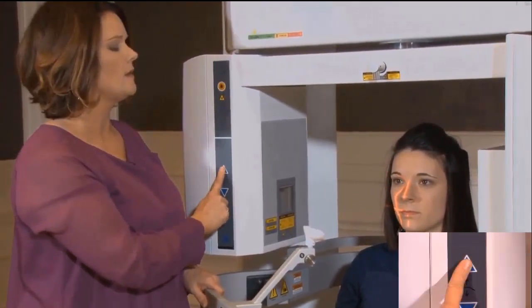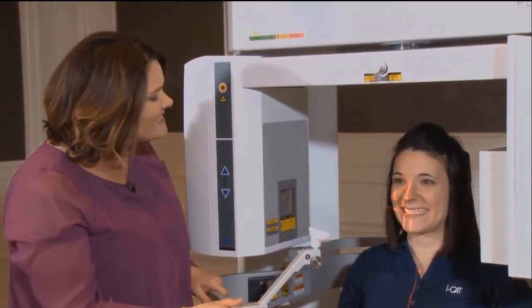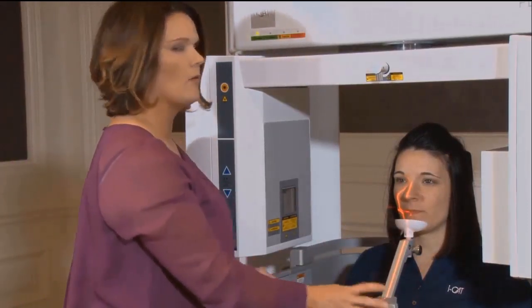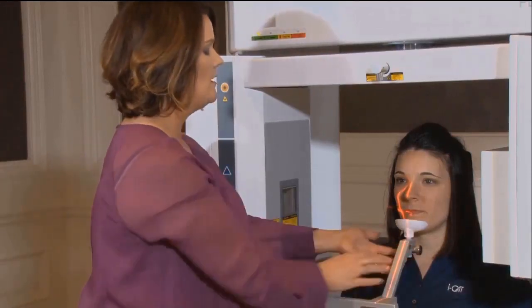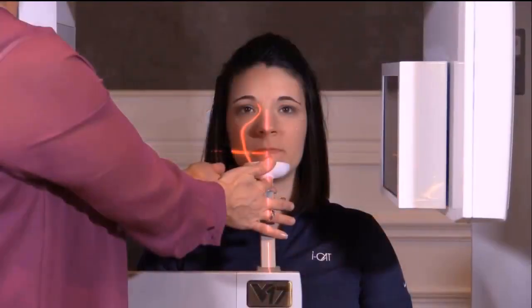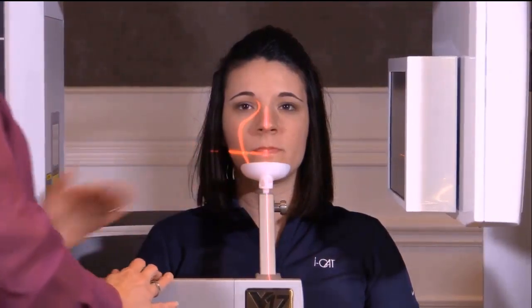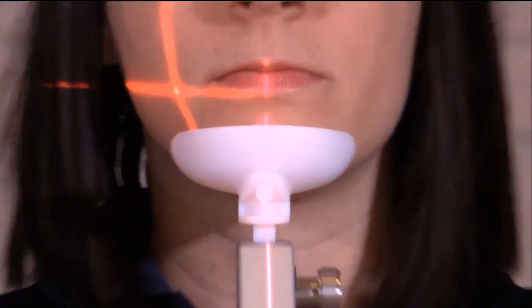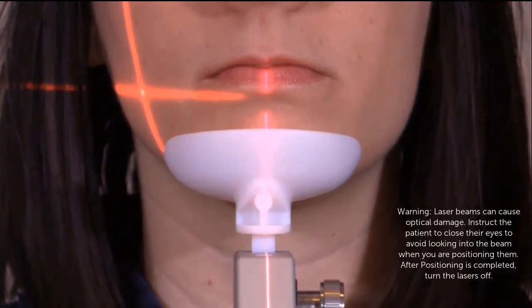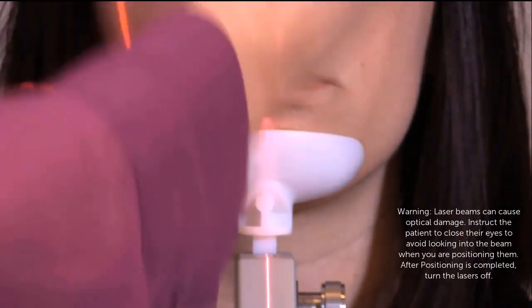I'm going to bring the patient's hair up. When they get close, I want them to give a big toothy smile. Now I'm able to close the gate and know that I won't interrupt or hit the patient. I then want to raise my chin cup up right below the patient's chin and lock it back in. I'm then going to bring her head into the chin cup to stabilize. I'm going to use my headrest support — there's a knob I'm going to bring forward and lock it down. I'm then going to evaluate where my patient's occlusal plane is again.